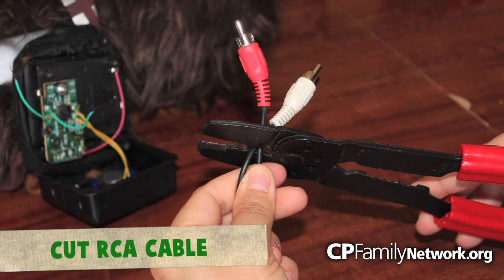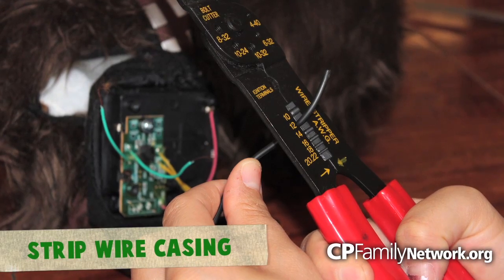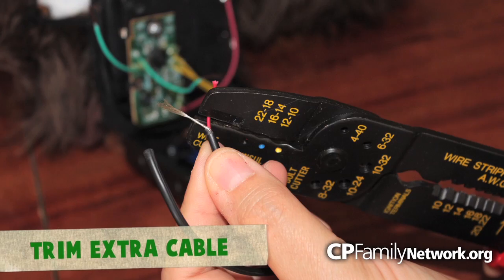Next, get your RCA cable and cut off the ends. Also strip the RCA cable to expose the copper wire. Crimp off any unneeded sheathing.